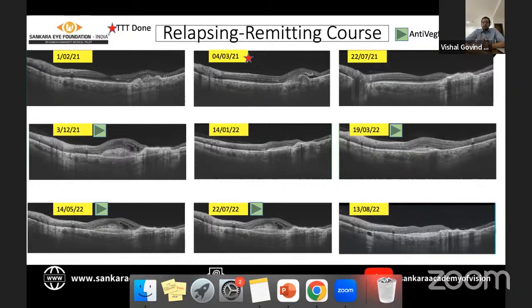Rather than switching anti-VEGF, I would ask everybody here if you would add a steroid to prevent the scarring. It's very anecdotal, but we have practiced this in a few cases, and I've had some okay results because of the amount of SHRM we see. Also, classifying the SHRM is very important. Are we looking at a scar itself at presentation, considering how irregularly he came, or is it a lot of SHRM where it's more exudation rather than a scar? These were the things striking my mind when I saw this patient. Switching does matter if the drying effect is not there, but what Dr. Divyansh has done, the drying is pretty good. So I don't think there's a point of switching.